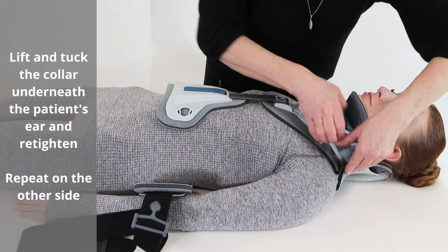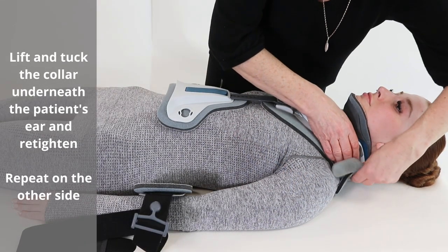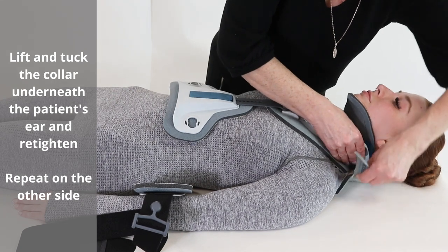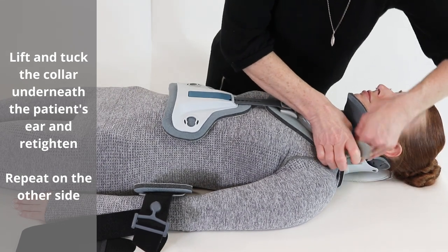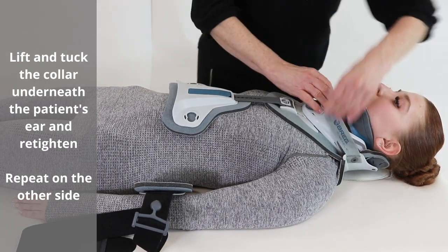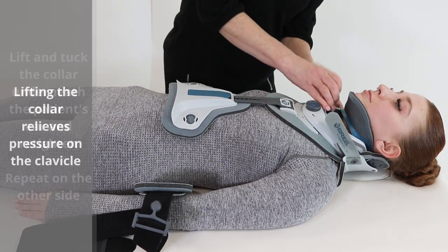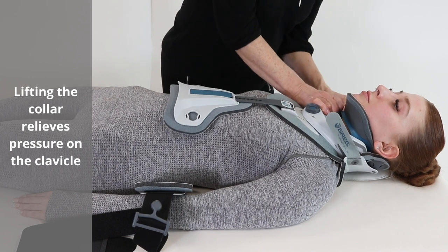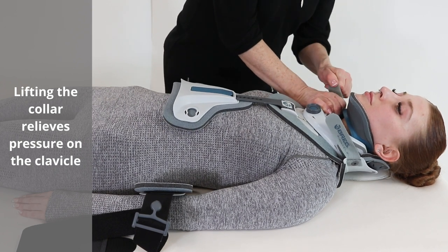Lift and tuck the collar underneath the patient's ear and re-tighten. Repeat on the other side. Lifting the collar relieves pressure on the clavicle.